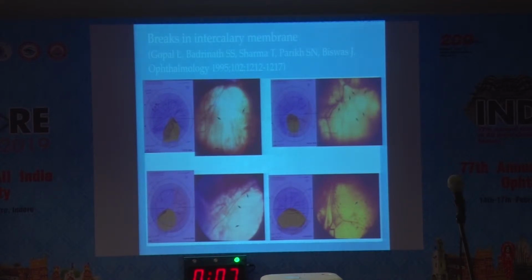More often what we saw was where the detachment is like this and spilling over into the coloboma margin in this quadrant. Right at this margin you will find a break which is slit like, where the margin of the break which is towards the normal retina is lifted up, but the margin which is away towards the coloboma is actually merging with the coloboma floor, so it's not visible. So it's not like a full oval break, but it is like a break with half an oval area which is cut off, and that is contributing to the detachment of retina.